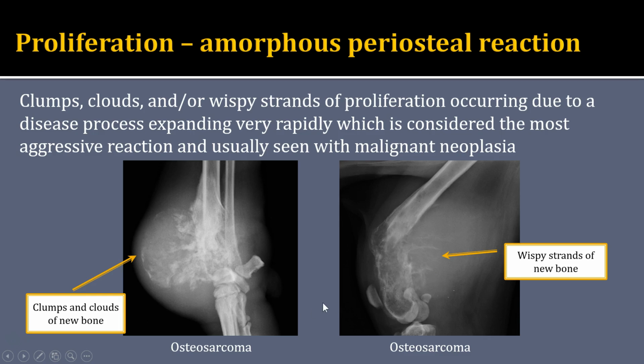But as with patterns of lysis, we may see mixed patterns of periosteal reaction. And then obviously, a lot of these disorders are going to have both patterns of lysis and patterns of periosteal reaction.